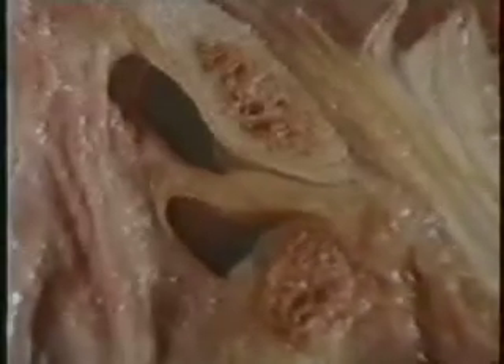The disk is here again, anteriorly displaced. The configuration of the joint compartments corresponds very well to what has been seen on arthrograms and to observations during surgery.